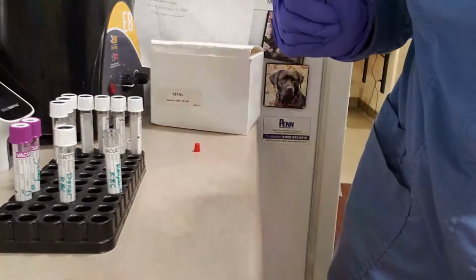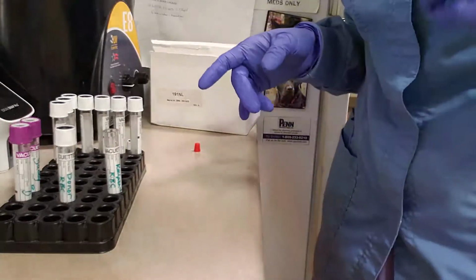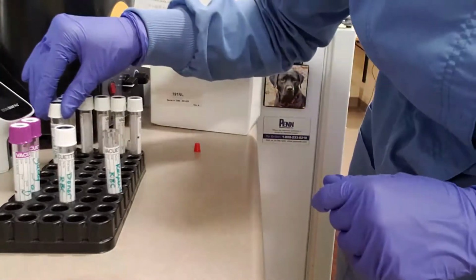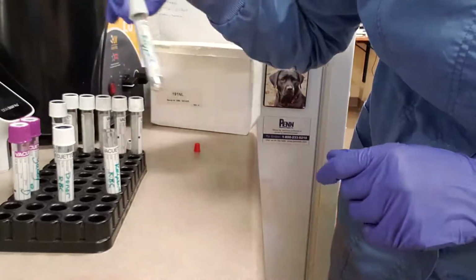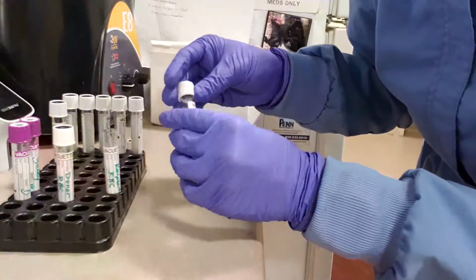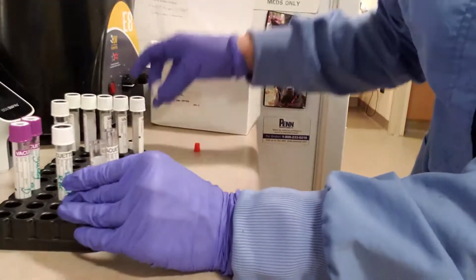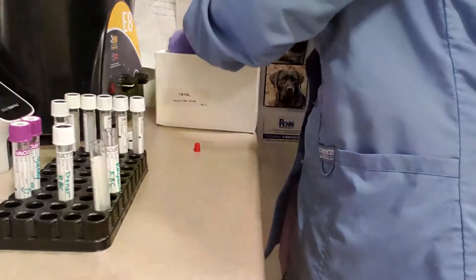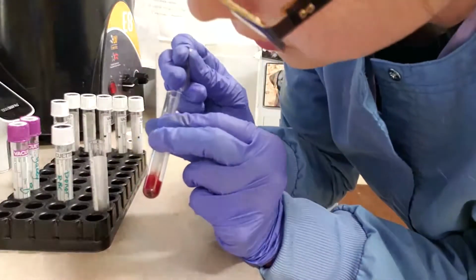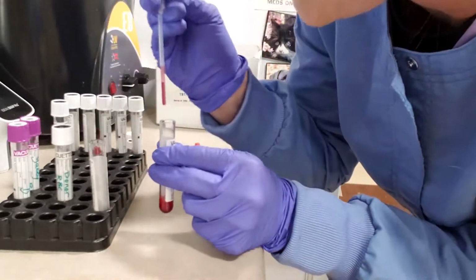Okay, so now we have our recipient red blood cells and our donor red blood cells, and we want to resuspend them to make a 3 to 5% red blood cell solution. The way we do that is we take 1 drop of red blood cells to 20 drops of saline. So this will be our resuspended red blood cell solution for our recipient. We've got our recipient red blood cell right here. So we will open this, and we will take 1 drop of our washed red blood cells and add it to our tube.